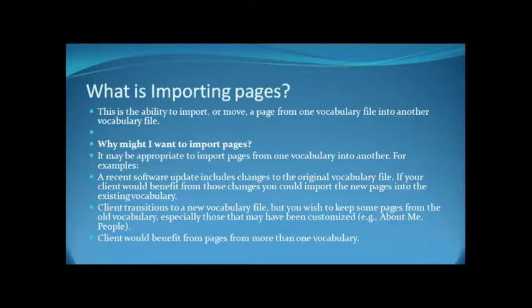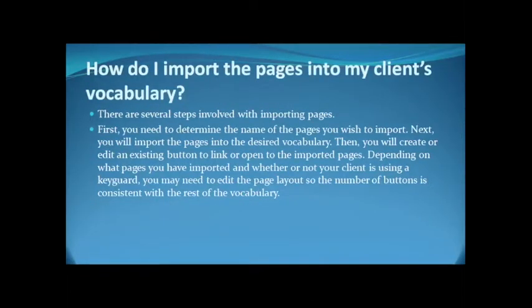So when you think about why it's important, like I said, if an update happened, maybe those books happened that you want to go in there, the lock page buttons, any of those pages that you want, you can import them in there. If, let's say, somebody's on a Word Power 20 and you're ready to bump them up to a Word Power 42, but you've done all of this programming on the 20 with all these pictures, you can actually just take those picture pages, the social pages, and import them into the new file. So there's a lot of reasons why to do it.